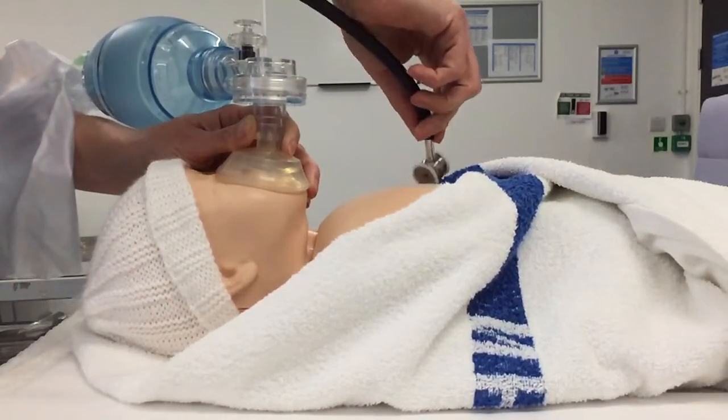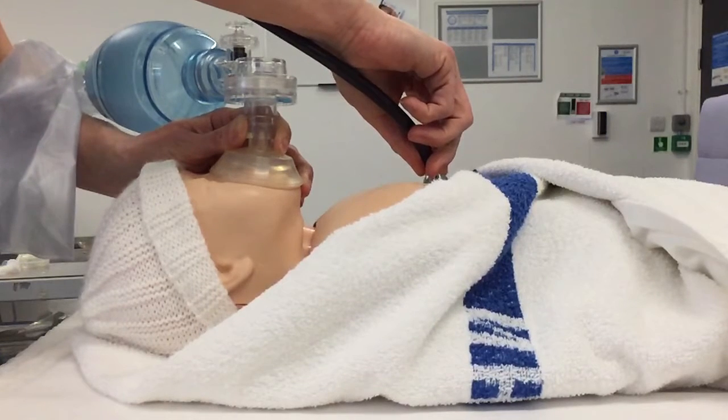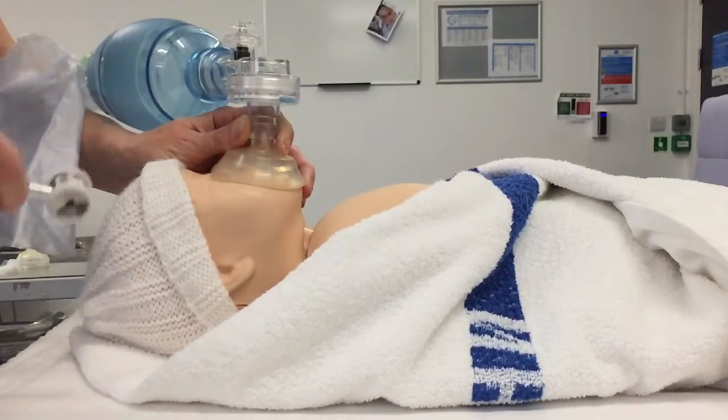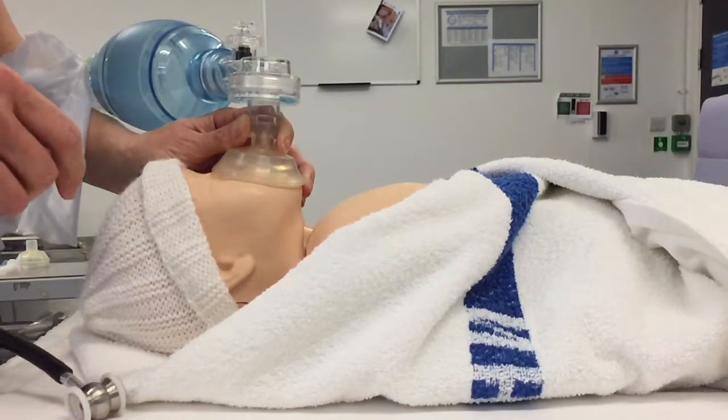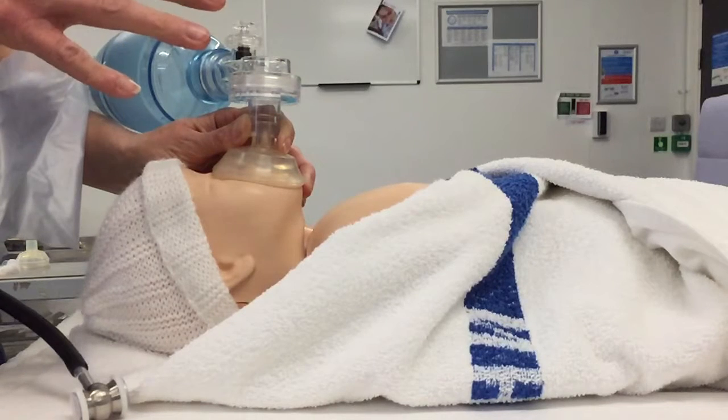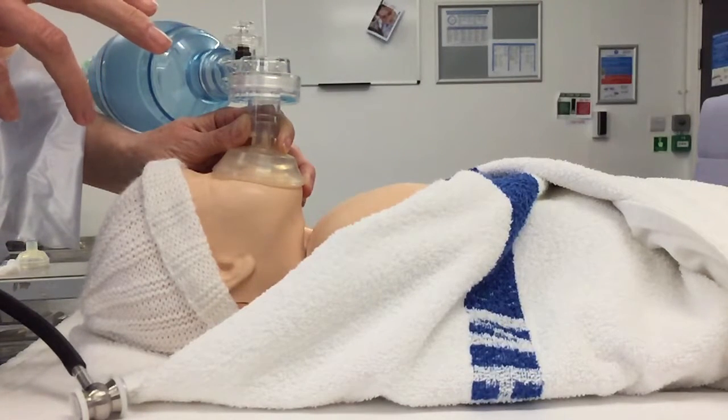And then I want to reassess my baby. So what's the baby's heart rate? The heart rate on this baby is still slow. And is my baby making any respiratory effort at all? No, it's not making any spontaneous effort. Did I see chest rise? Yes, you did. And the colour and tone of baby? It's still pale and floppy.